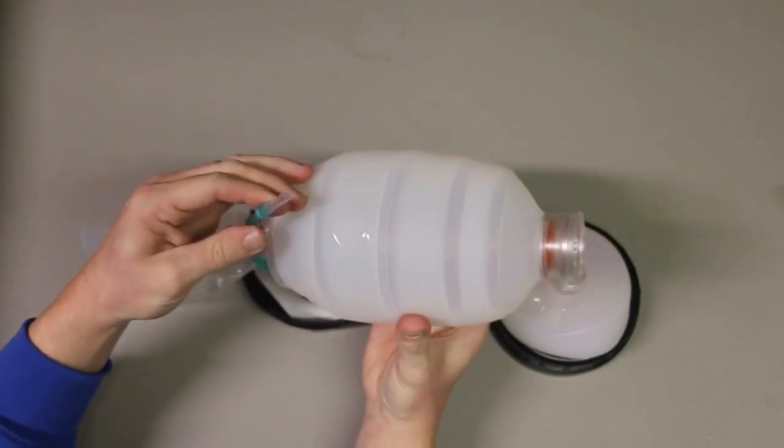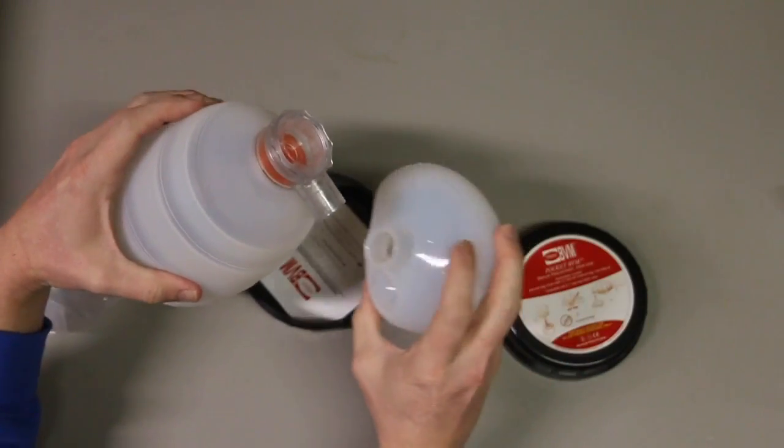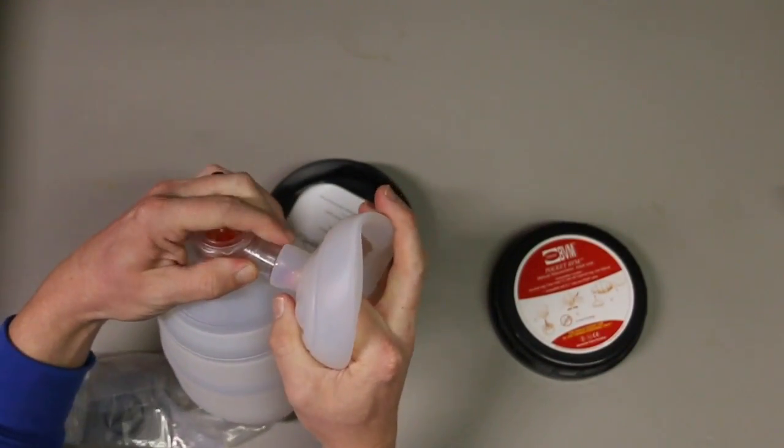The actual BVM part here — so we can attach it to oxygen. This reservoir will fill up and then we can attach our face shield here.